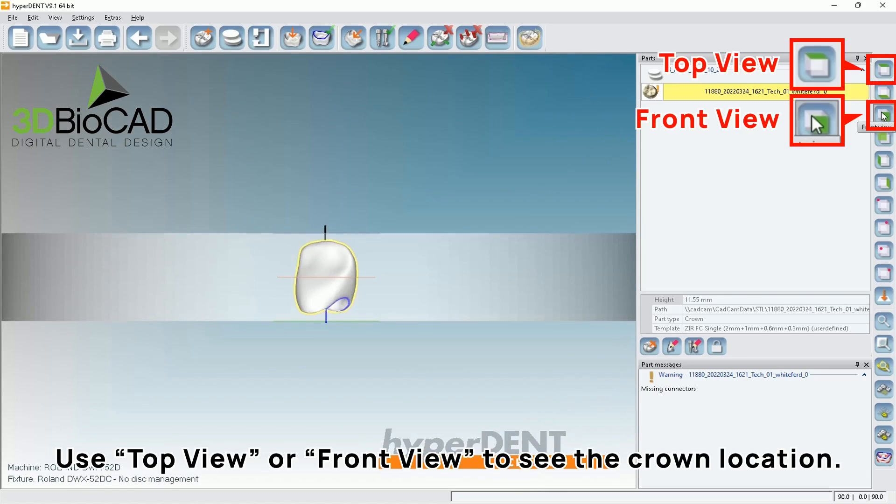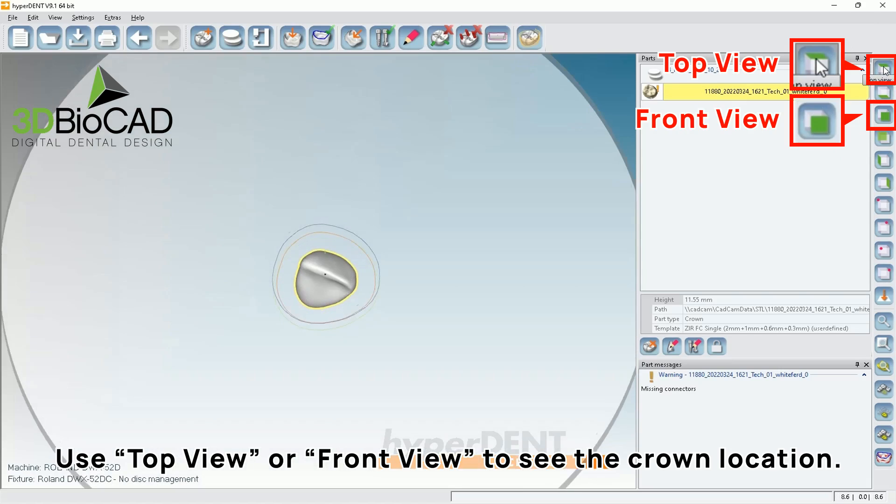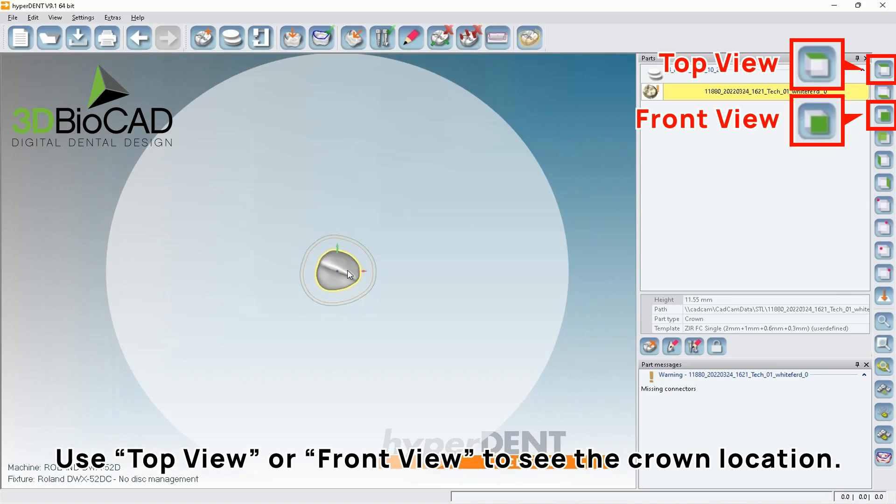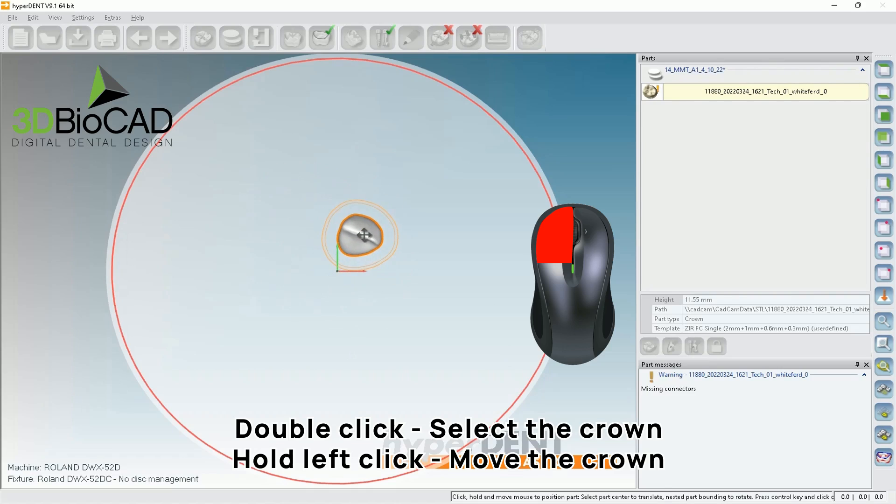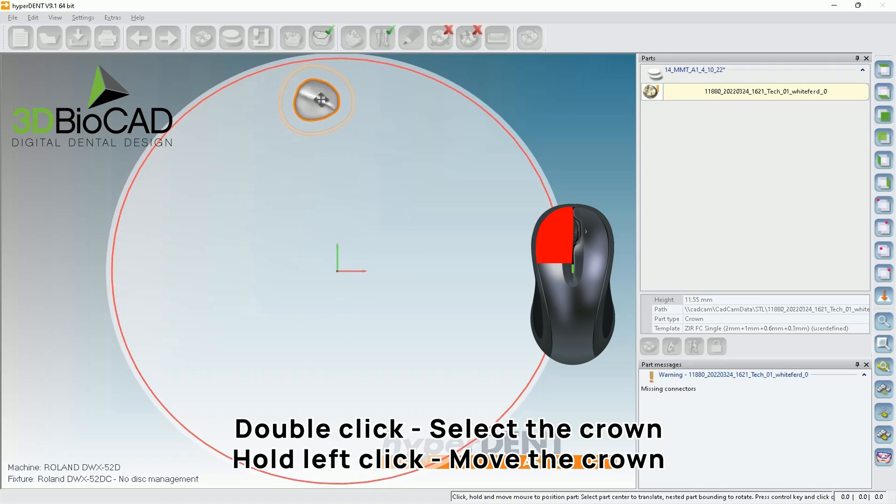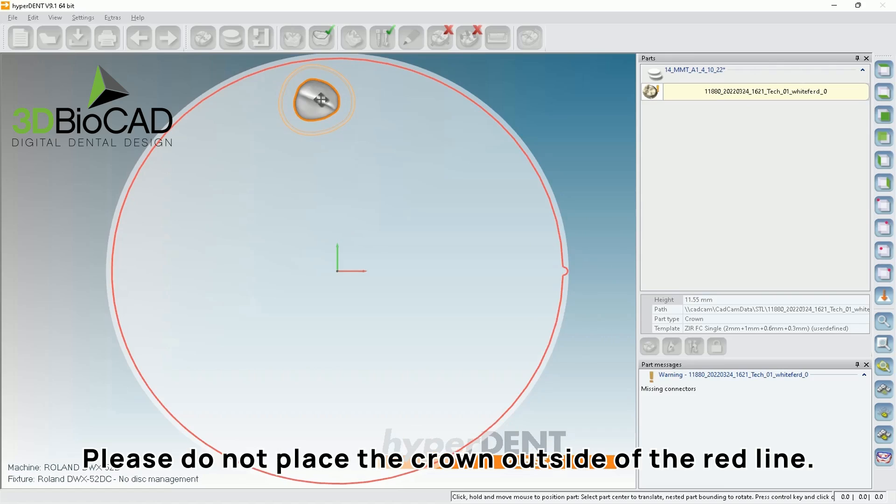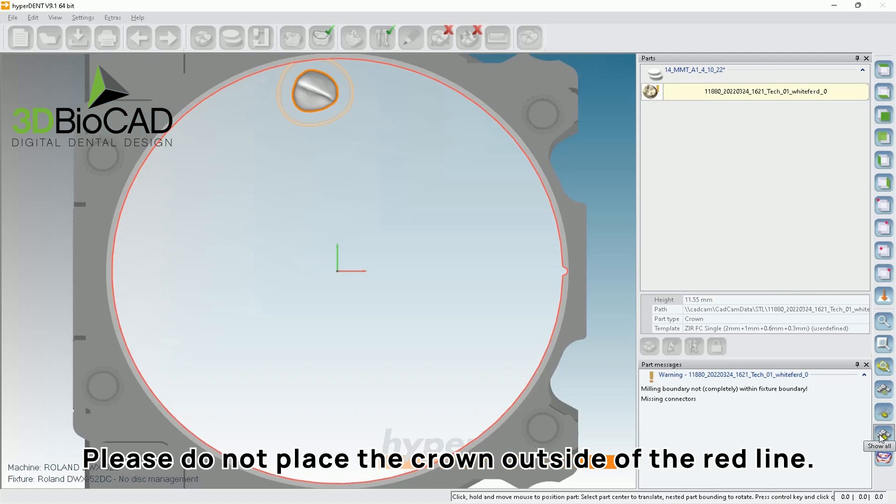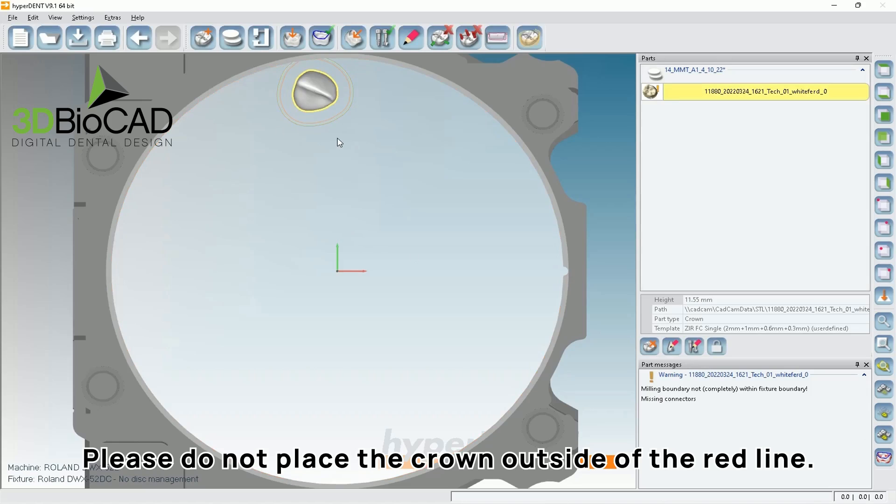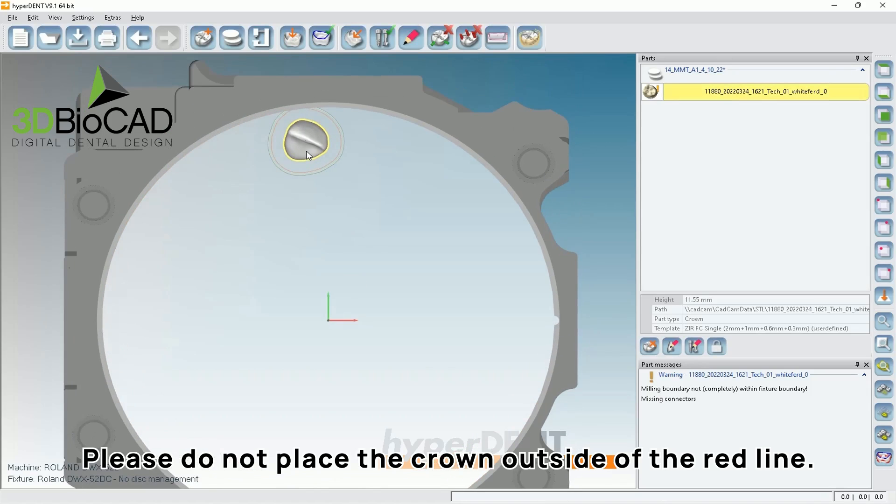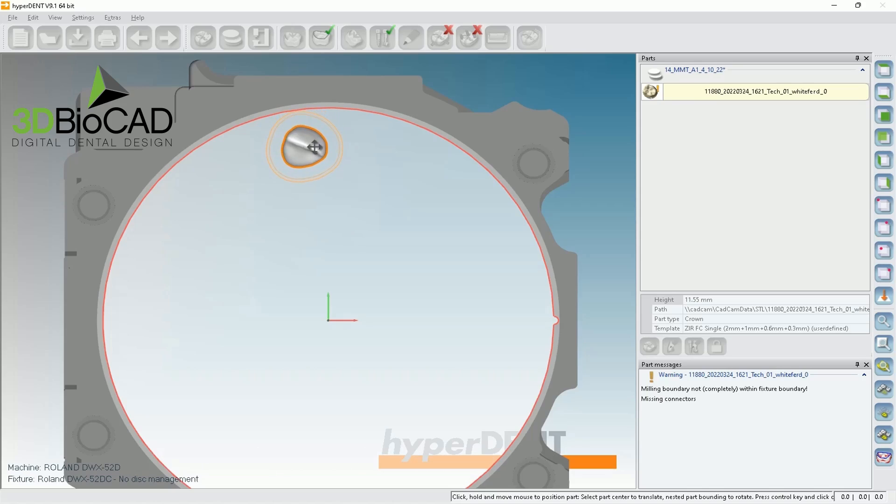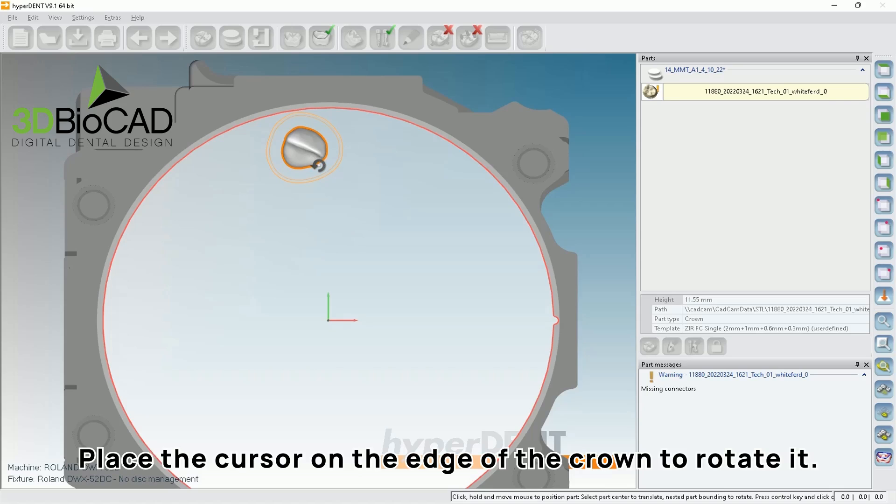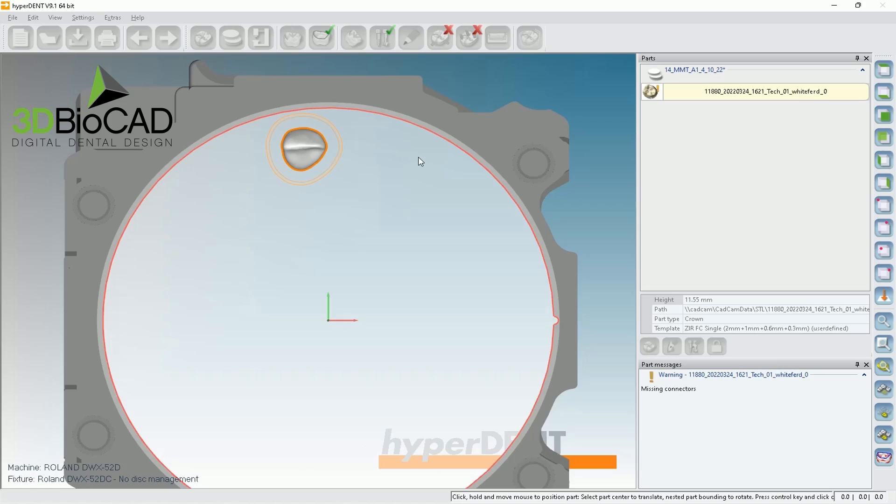So from here, as you can see, I'm selecting the top view and also front view in order for me to utilize where my crown is. So basically, you can double click, then you're able to move them. So I am left clicking and holding the crown and moving it. So just bring this back in and bring the mouse cursor to the edge of the crown. Then it will change the shape. Left click and hold. And rotate. Then you'll be able to rotate them.